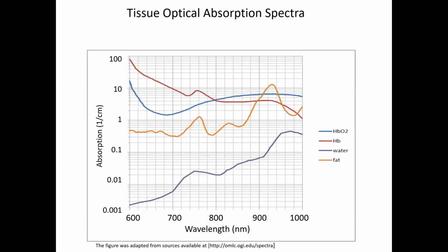The important thing to point out about the image is that the contrast is actually optical contrast, even though it was delivered through an ultrasound wave. That means that you can get optical information at a high resolution from deep tissue, even with scattering tissues such as living tissues. And so why is this optical contrast really useful for us?